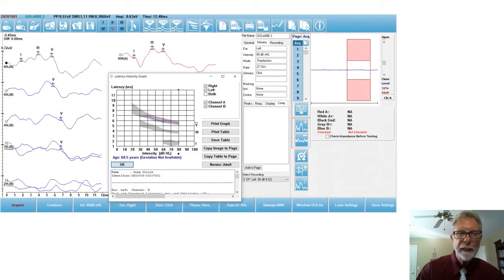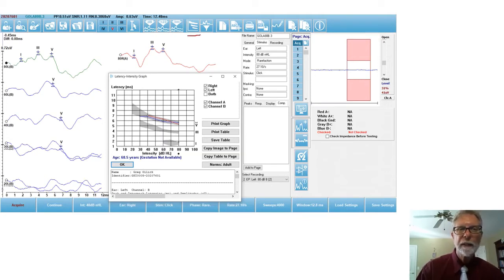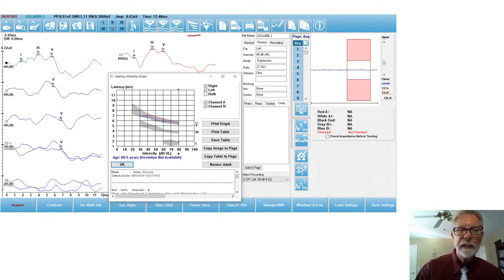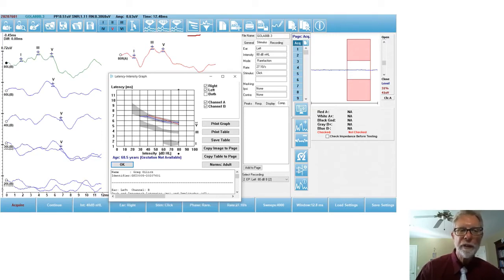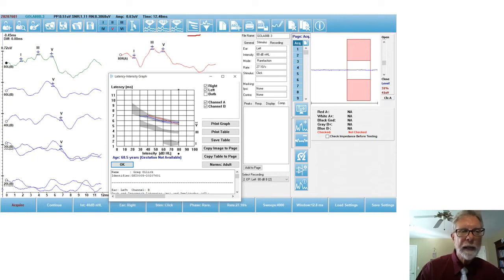This slide is an expansion. This is what happens when I click on this icon right here. It's the icon I would click on in order to get a latency intensity graph. Here's a latency intensity graph for wave one, three, and five with the shaded areas shown. They are the norms. And it's active. I can simply click on that icon and pull this up and have it a bit. I can move it around.